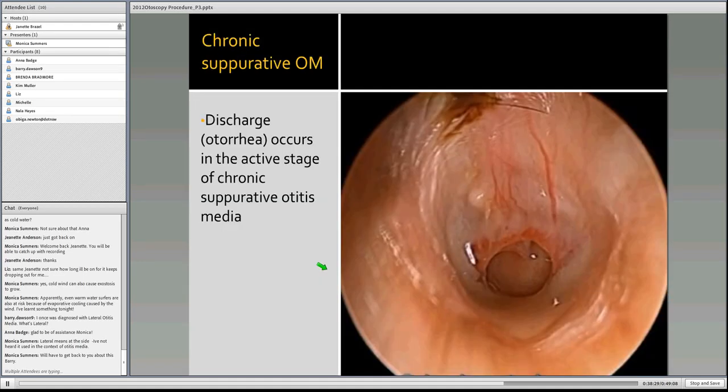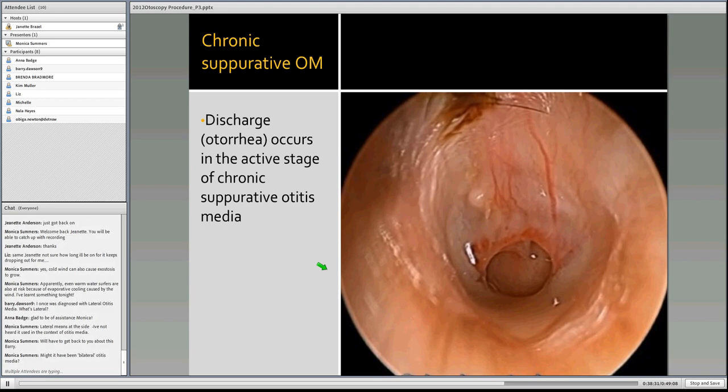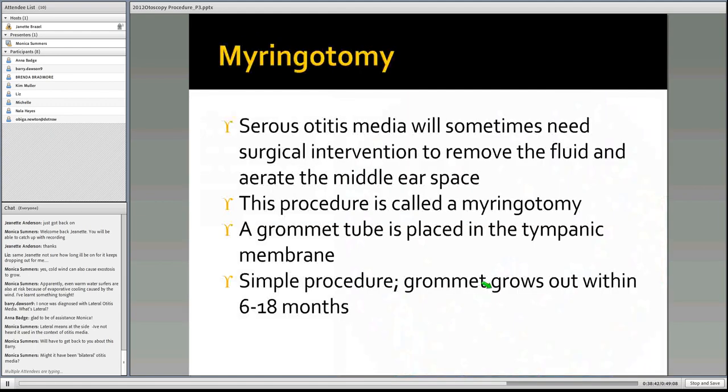And here's a nice picture of it. We can see a very wet looking perforation. The eardrum has no landmarks, it just looks pretty yucky. So that one's straight up to the doctor.